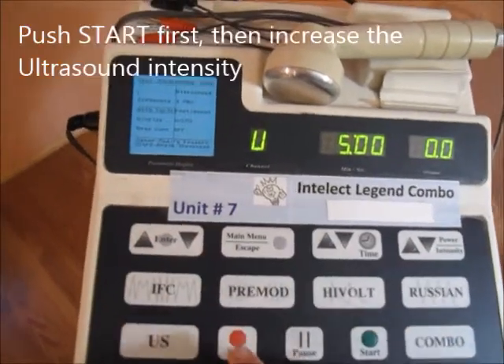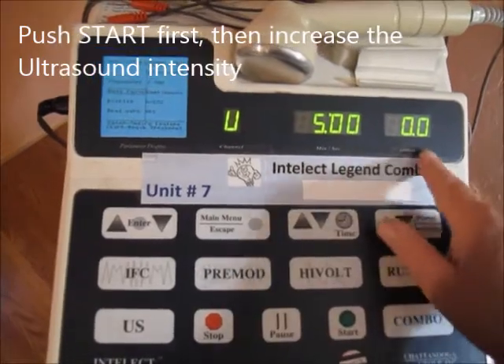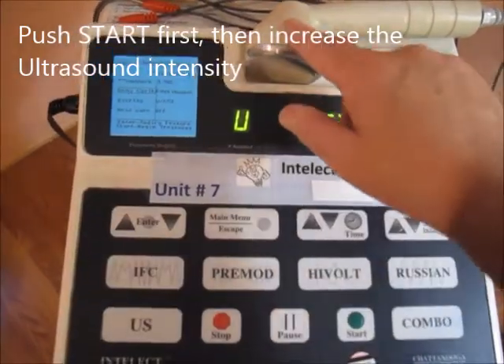When the machine needs to get started, you need to push start before you're able to change your intensity to actually cause the heat.